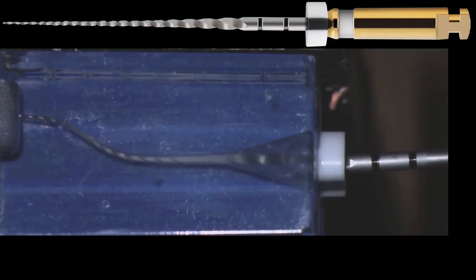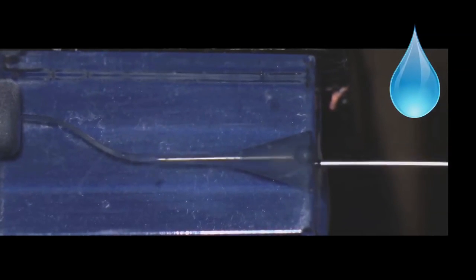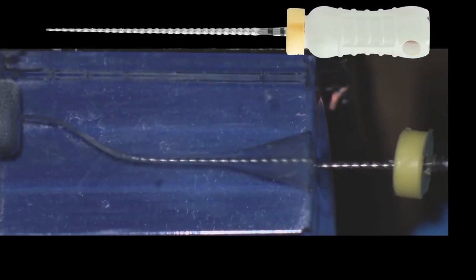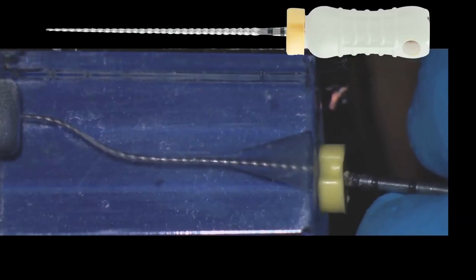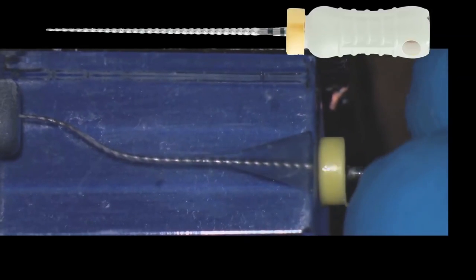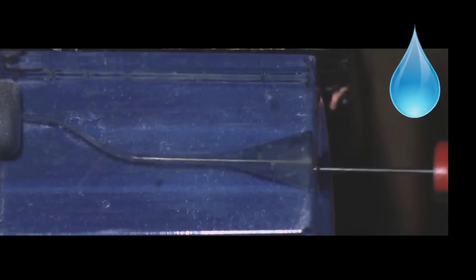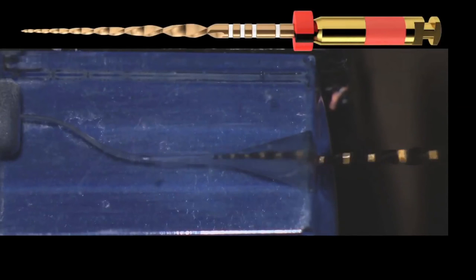In this case, we use the ProGlider. In increments of 3 millimeters, we go all the way to working length. We irrigate again. We ascertain that we have not blocked ourselves with the instrument that we established the working length with. Then we remove the instrument. We will irrigate again. And now we are going to proceed to the canal shaping with WaveOne Gold.